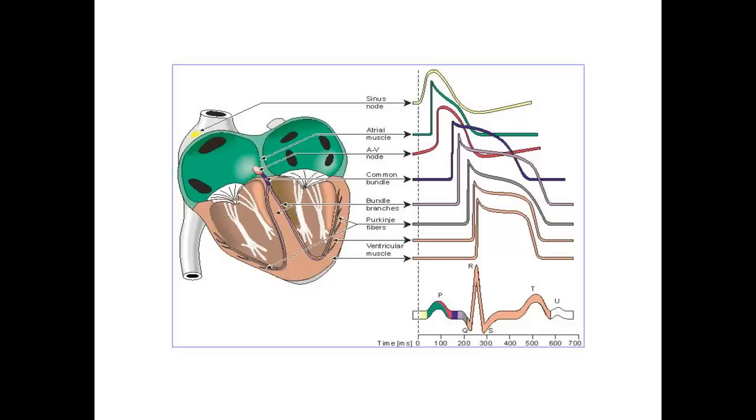And so we use the R wave as a proxy simply because the P waves and the T waves sometimes disappear or get muddled. The R wave is the most prominent and the most visible, and so that's what we use to measure the distance between two beats.